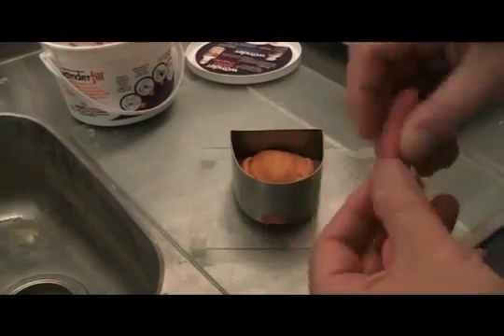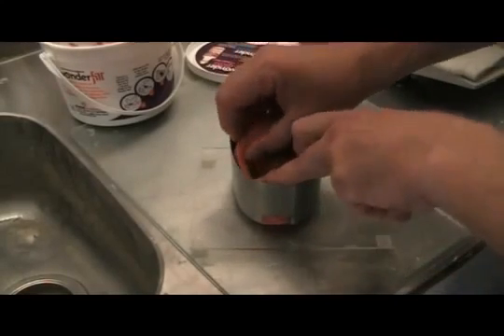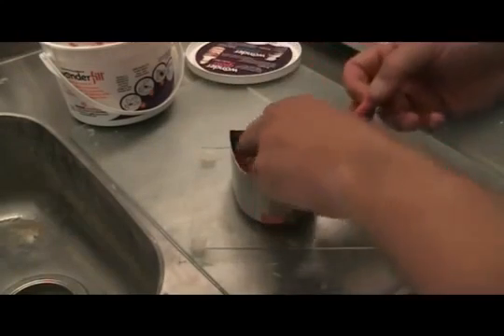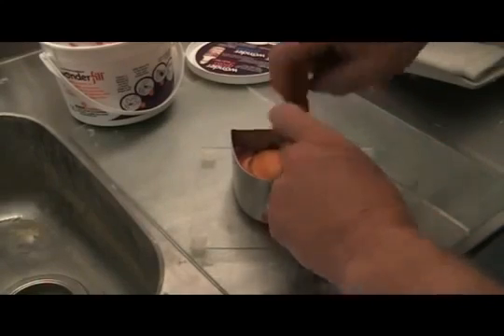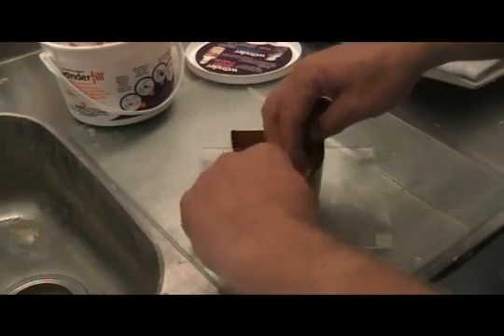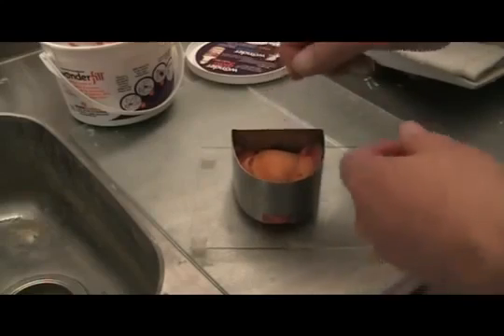Again, I'm doing this for example's sake. If I didn't have to stand around a camera, I could show you that it happens quite quickly. But basically, I just take the material and press it all the way around. And what we're doing is we're building our land area around the outside of the impression. Okay. Once I get most of it in place, I'll then grab myself a little tool.